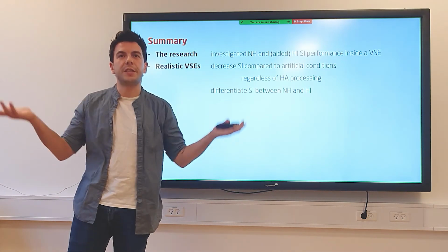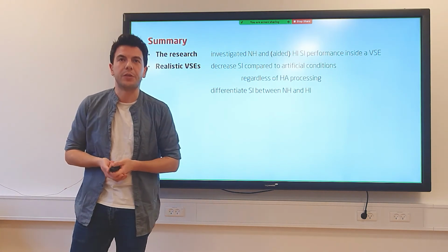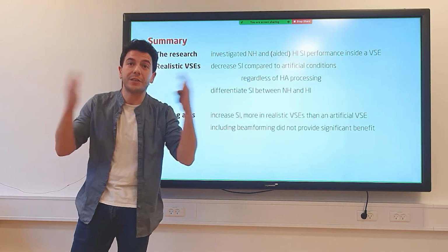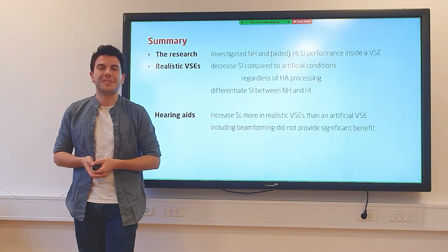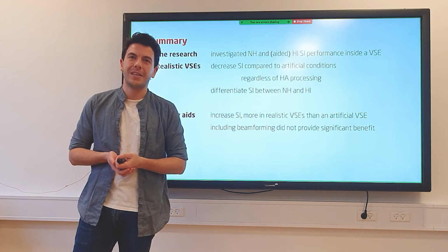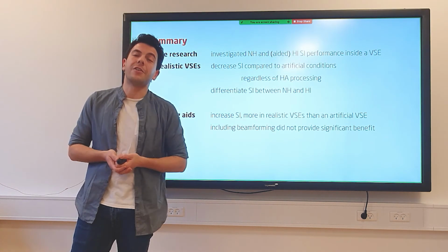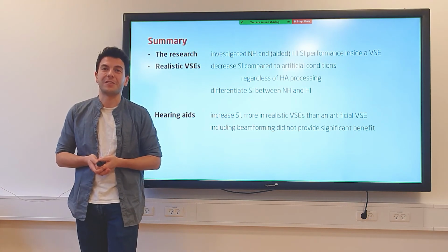They also differentiate speech intelligibility to a greater extent between normal hearing and hearing impaired participants. If you add hearing aids to the mix, this increases speech intelligibility, but more so in realistic VSEs. And finally, in our implementation of the beamforming strategy here, we did not see any significant benefit in our VSE.